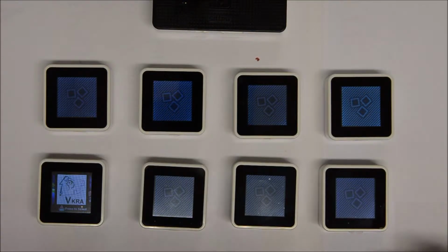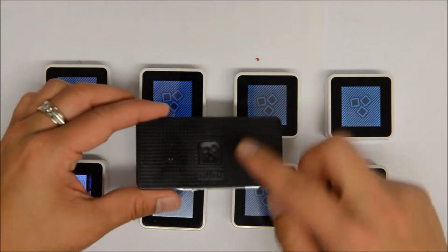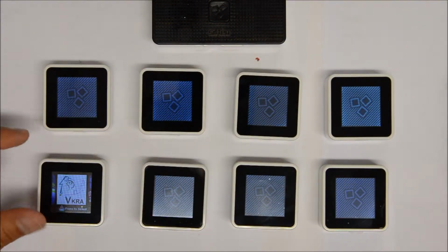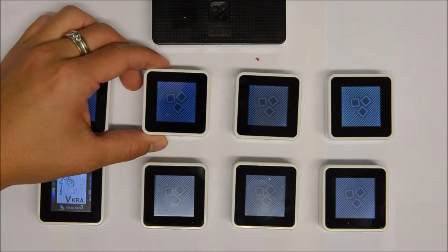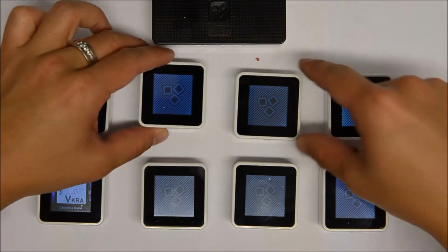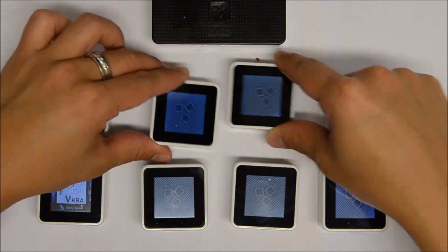Sifteo is advertised as a standalone toy. It consists of a base unit which has a speaker on it with a volume control. You can buy multiple cubes and add up to 12 cubes altogether. Each of the cubes contains a touchscreen, 128 by 128 pixels. It also has accelerometers and a proximity sensor to detect if the cubes are touching on any of the sides.